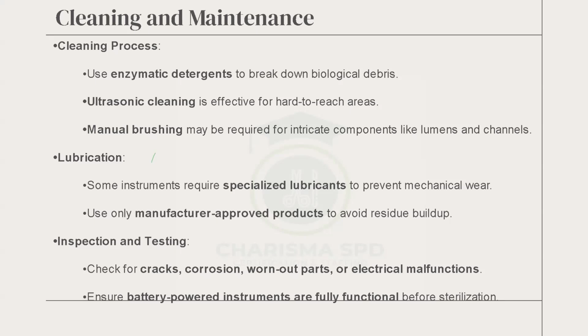So check for cracks, check for what? Corrosion, fading, stiffness, the trigger not working, check for all of that. Loose parts hanging, check that. Okay, if the cord is broken, it means that somebody can get electrocuted, check that.